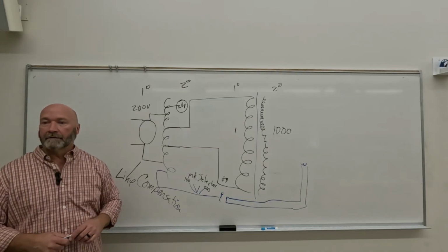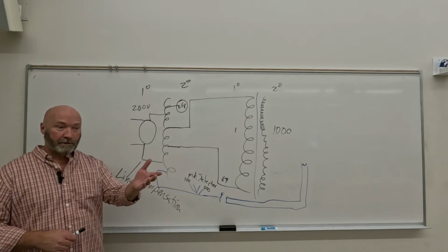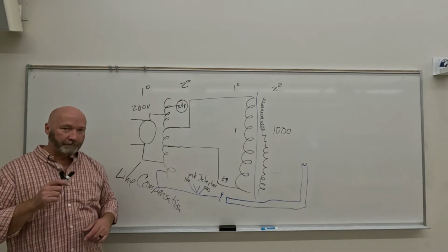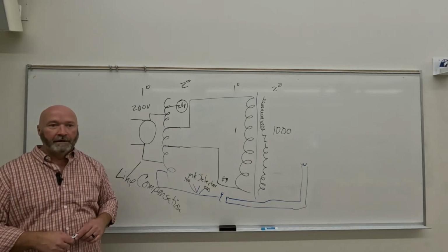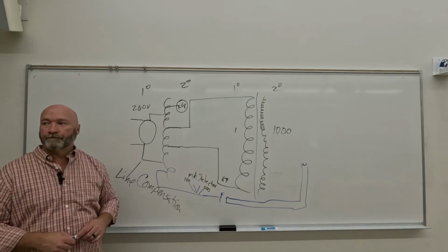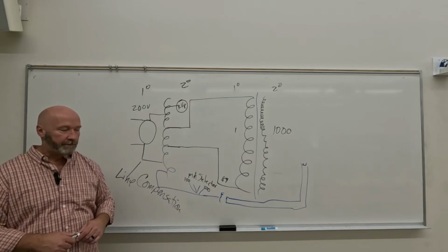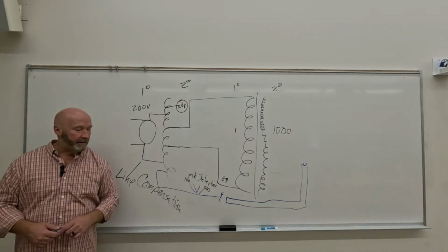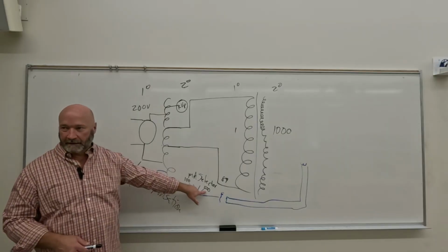Voluntary and involuntary, right? Exposure time being one of them. Careful instructions for voluntary motion. For involuntary motion, shortest exposure time as possible, right? So let's say we need 50 mAs. How do we get to 50 mAs? Could we use 500 mA at 1/10 of a second?